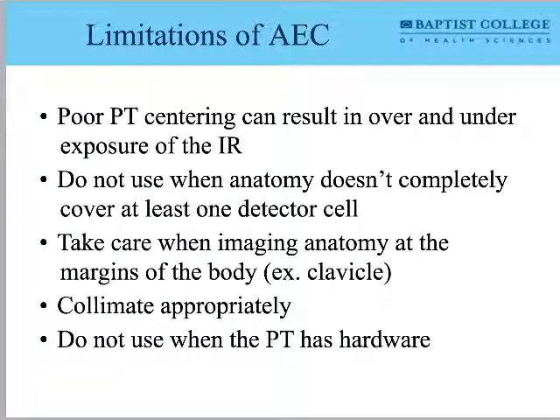Okay, so hypothetical question. A patient comes into the emergency department with a flashlight in their rectum, right? We use the AEC center photocell on their KUB. How is the image going to appear?